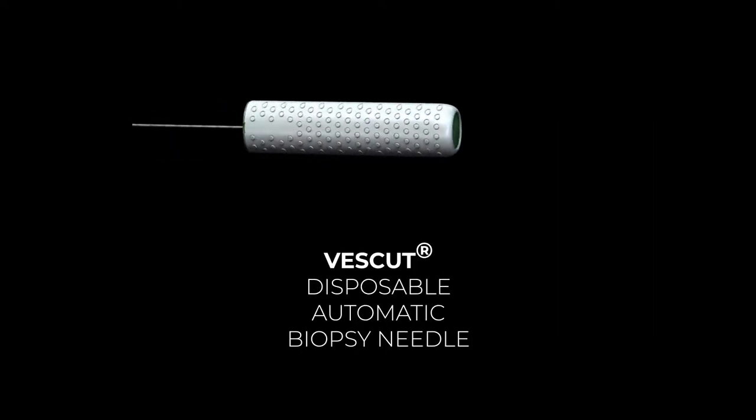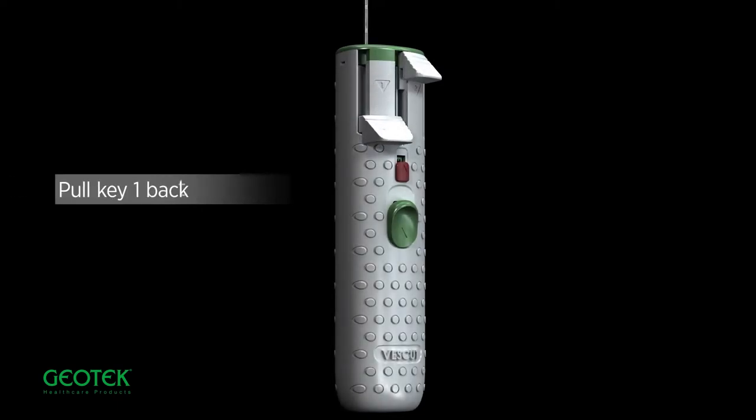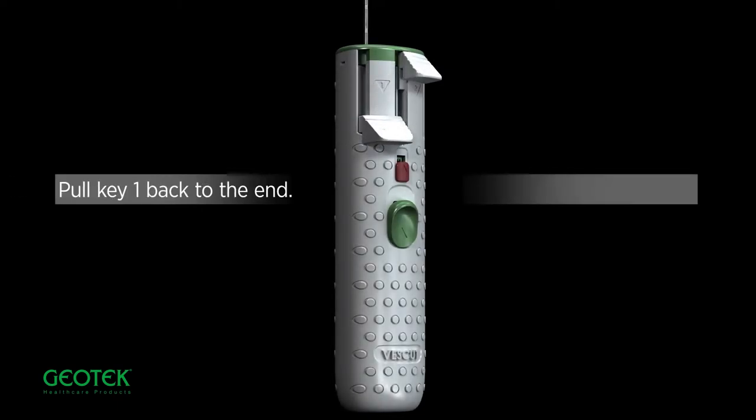Vescut Disposable Automatic Biopsy Needle. Pull key 1 back to the end. Pull key 2 back to the end.